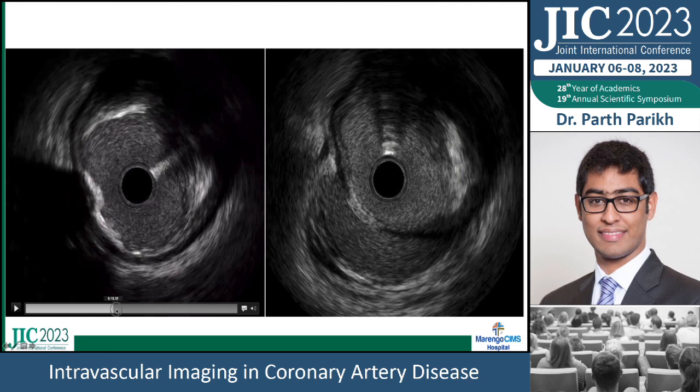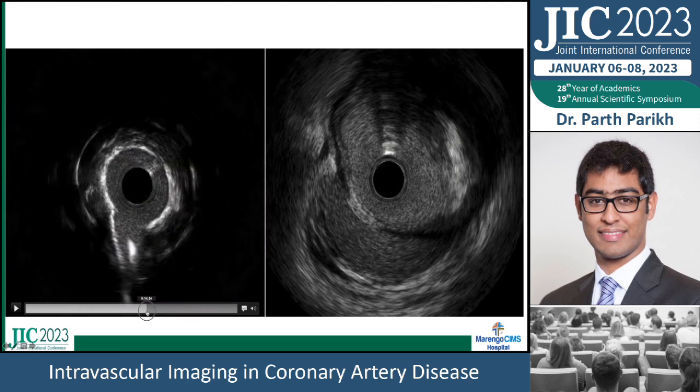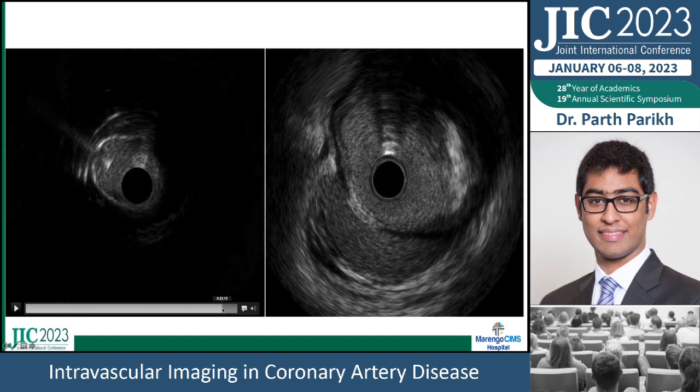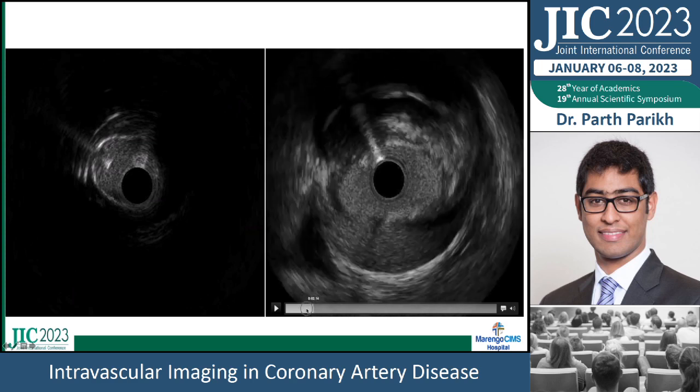And this is in the LAD pulling back. And as we come into the left main here, you can see there is concentric calcification. It's a small vessel compared to the LAD, and you can't really see anything beyond. So there is dense calcification here. So this imaging modality tells us that we do need to modify the calcium for the stent to expand. Otherwise, the stent is not going to expand properly in the left main, which would not be a good thing.